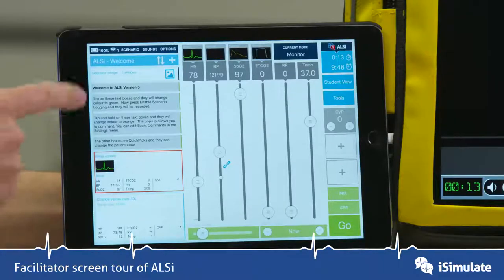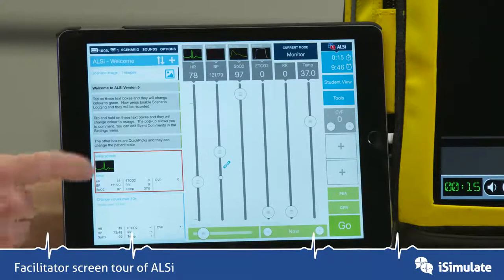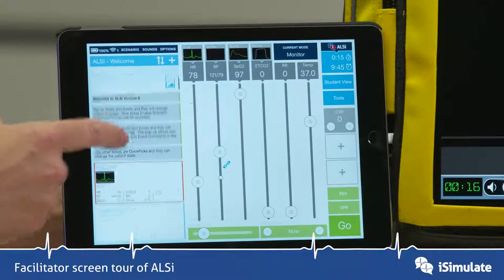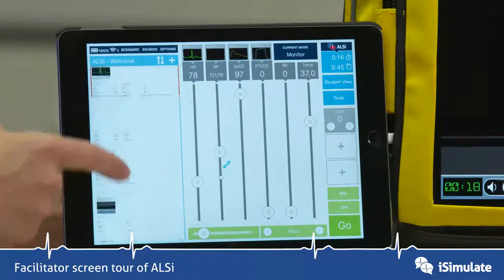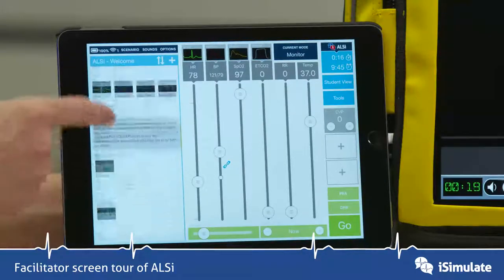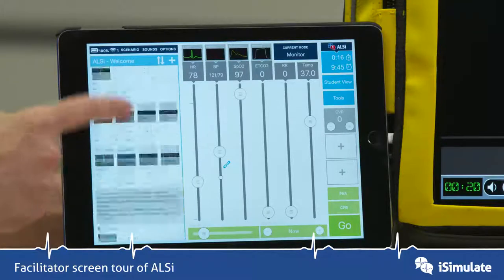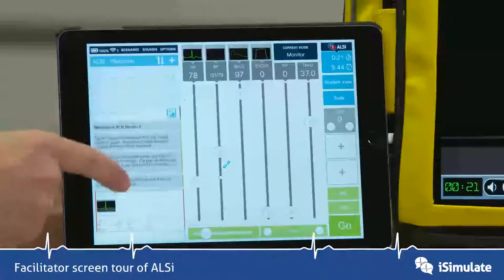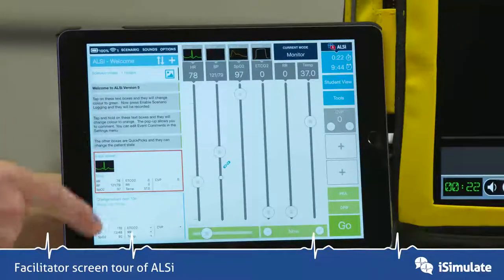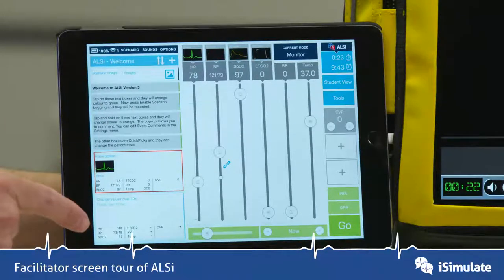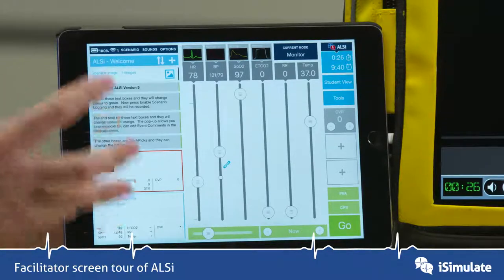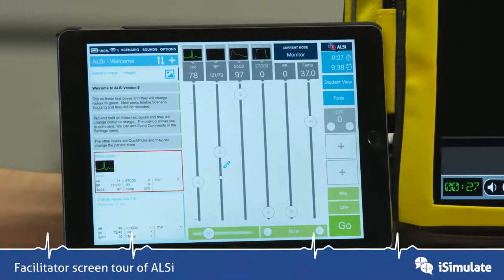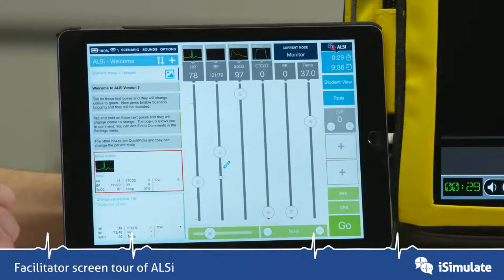Starting on the facilitator screen with the first left-hand column, you can see I can scroll up and down through various boxes which we call quick picks. These can do many different functions and we'll look into those a bit later on.